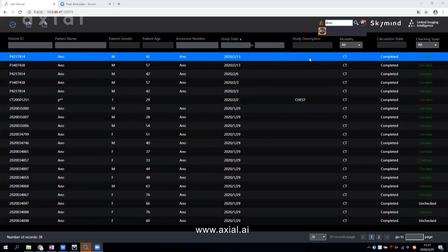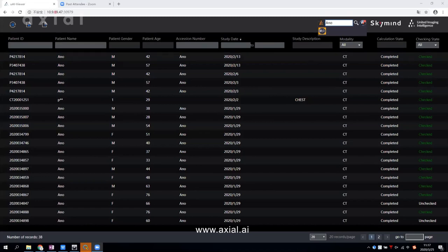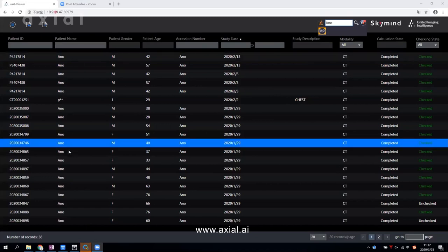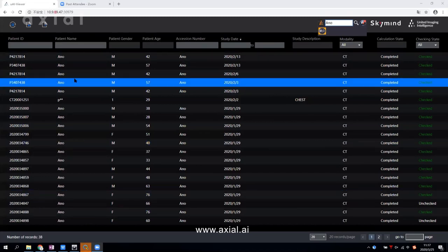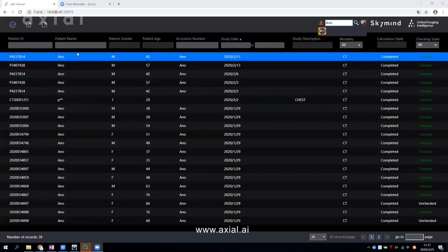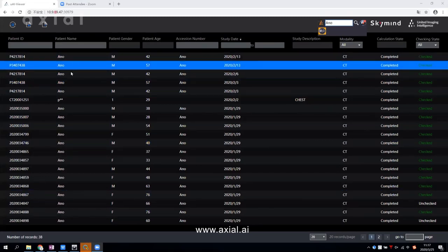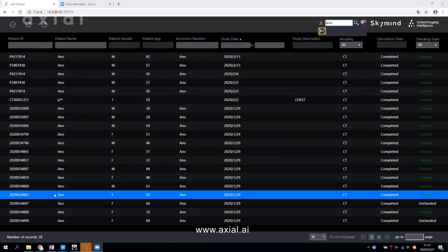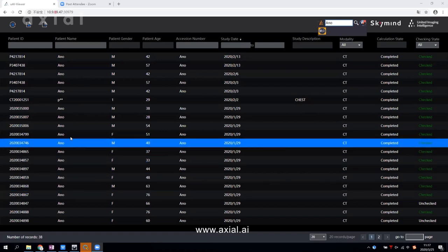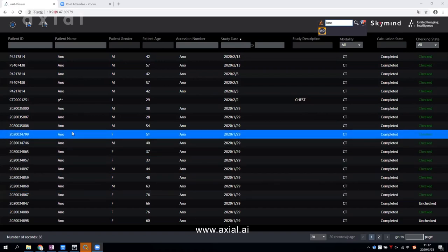What you see here is the main page of Axial AI, where it shows the most critical information of the patients, including patient ID, name, gender, age, and so on.